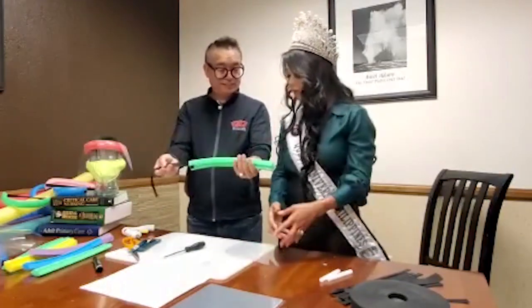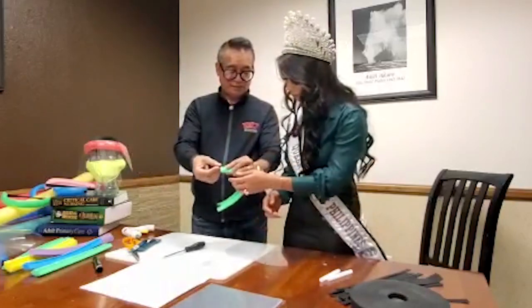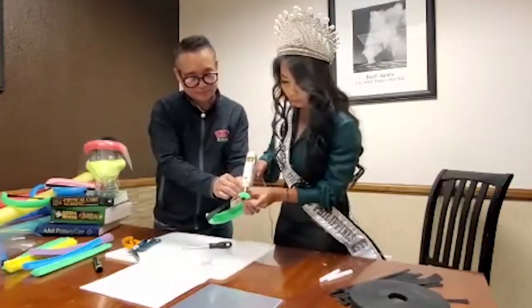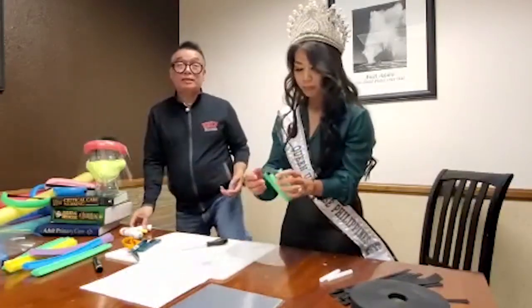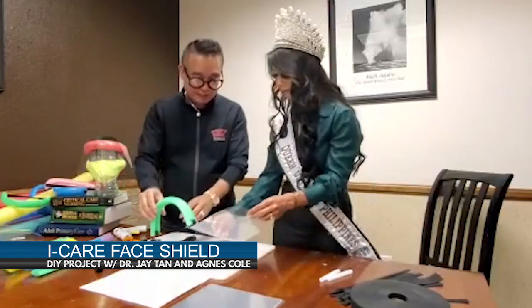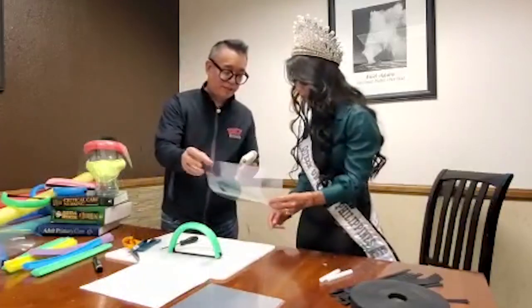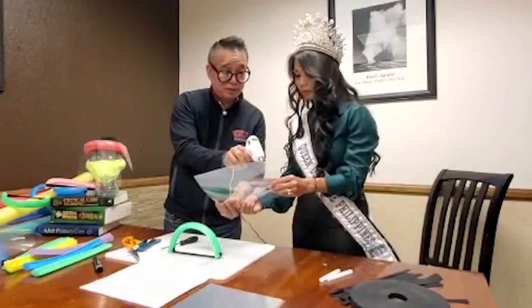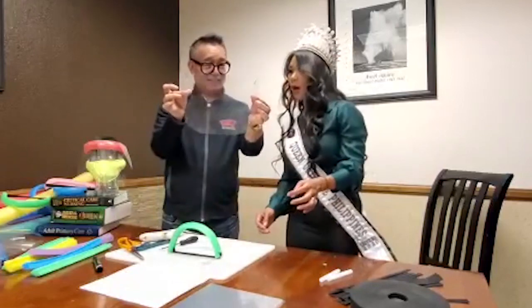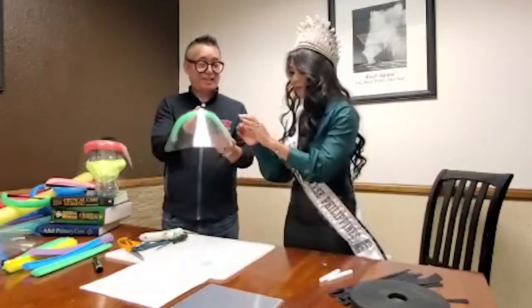All you gotta do is do the opposite. See? You do it there. You can do it. Now, we are into the final part. Now you have this round thing where it fits here. All you gotta do next is, I'm gonna stand it. Then we could put a glue gun here. You can hold it there. I'll put a glue there. Another glue to the end. So it would look like this. Wow. And then it sticks, so easy. There you go. Then you will have a face shield.